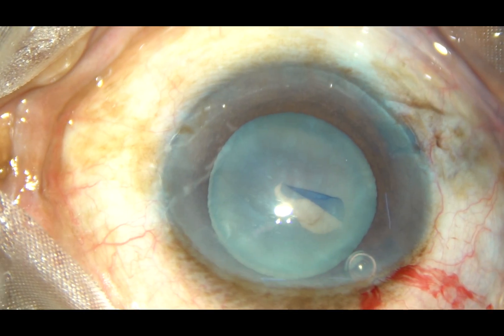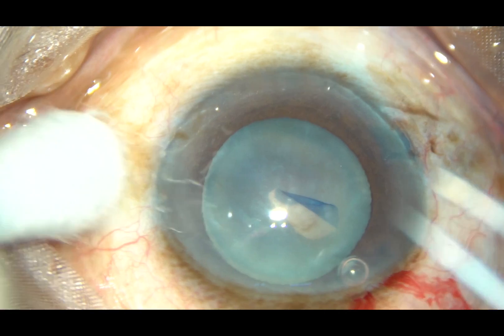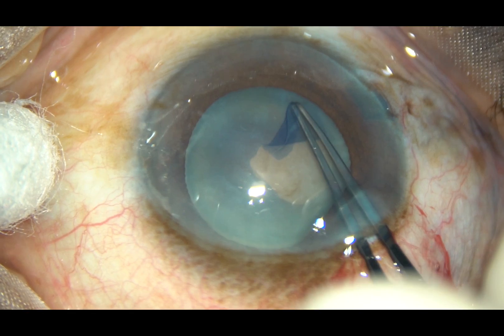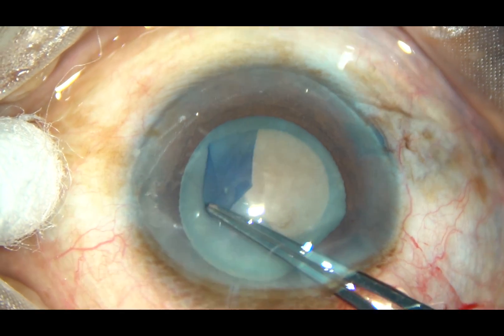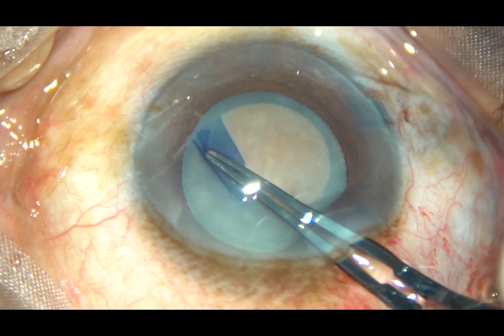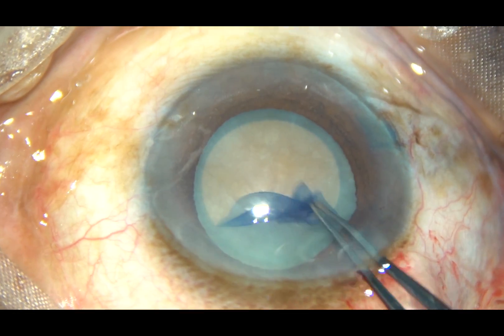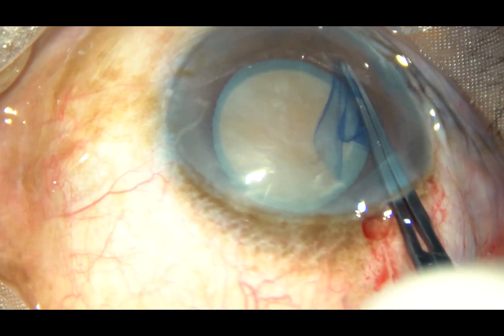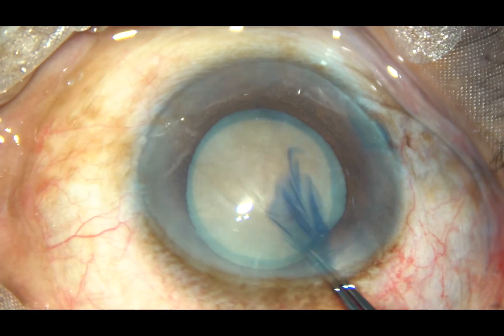Now, the anterior capsule has been incised with a 26-gauge bent needle, and this big flap has been raised. Now I take the utrata forceps, lift the anterior leaf of the main incision, and go all around. Remain at a little distance away from the margin of the pupil — the idea is not to touch the iris.